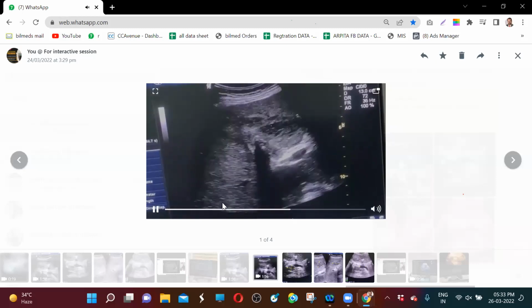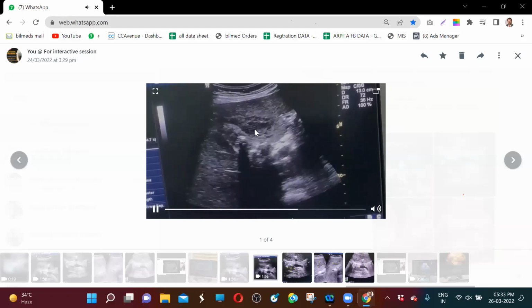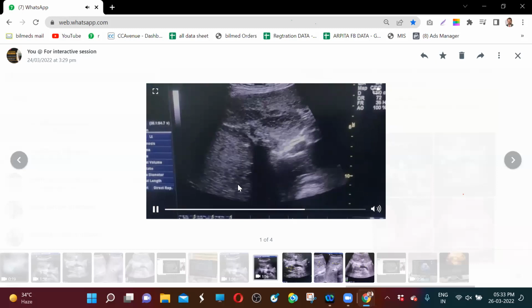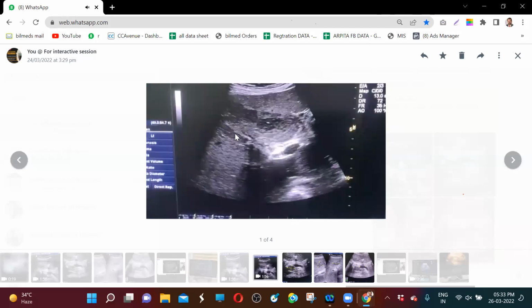35, 40 years. Okay. Now concluding, a 30, 40 years patient with an altered echotexture area next to the gallbladder. Gallbladder is having some calculus over there. So the first point which I have to think of is that the area next to the gallbladder is very favorite for fatty infiltration or fatty sparing.